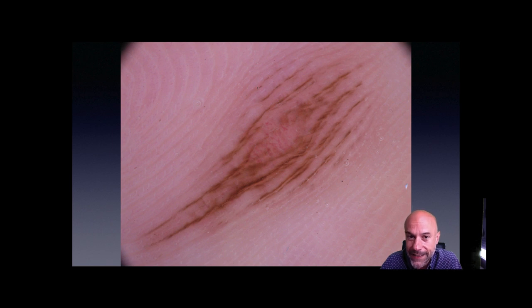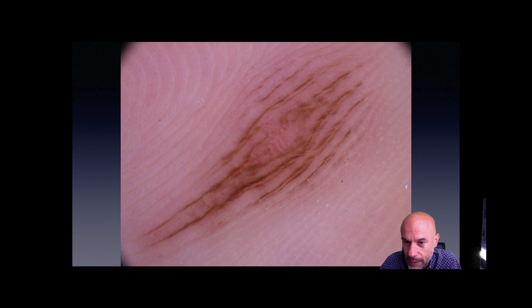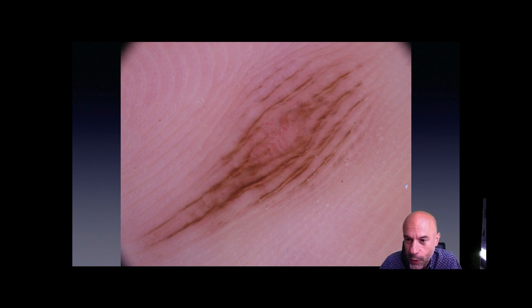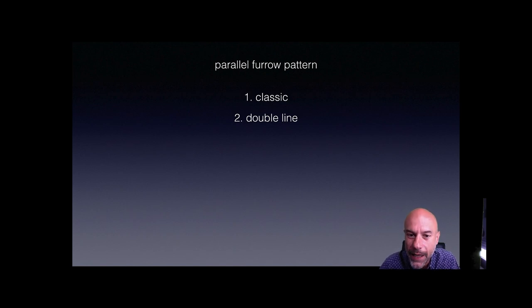In the next example, we can see again a pattern of parallel lines. In the upper part, the pigmentation is located on the furrows and the ridges are free of pigment — I can also see the eccrine duct openings. But in the central part of the lesion, on each furrow there is not just one line but two lines — two parallel, very close pigmented lines. The ridge remains free of pigment, but on the furrow we see double lines. This is the so-called double line pattern, which is a variation of the parallel furrow pattern.